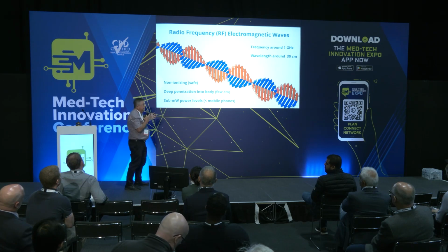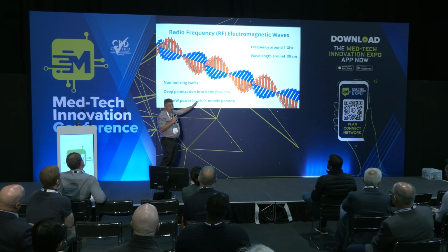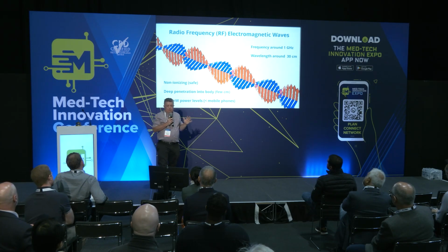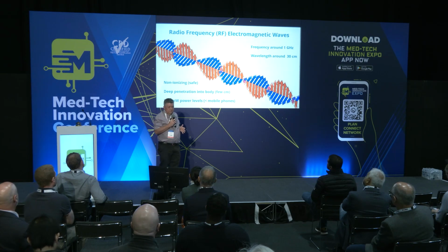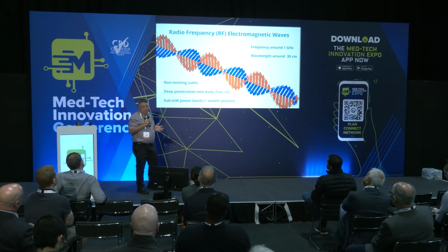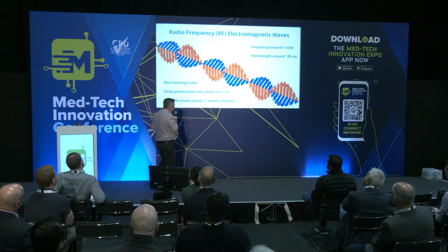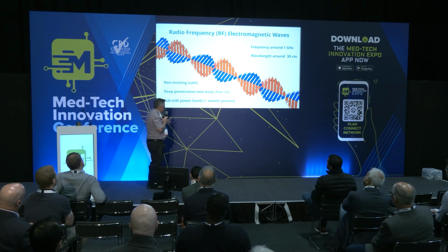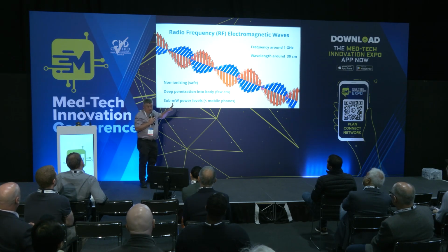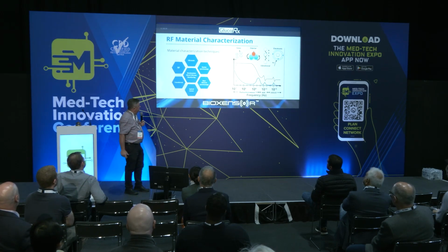It's non-ionizing, but more importantly, we can penetrate the body by a few centimeters. So it's not a surface measurement. You are getting at blood vessels. You all know that you can cook your baked potato in a microwave oven, for example, right? That's a few centimeters in diameter. And we're using here very low power levels, way below the levels of a mobile phone. So it is electronically safe.